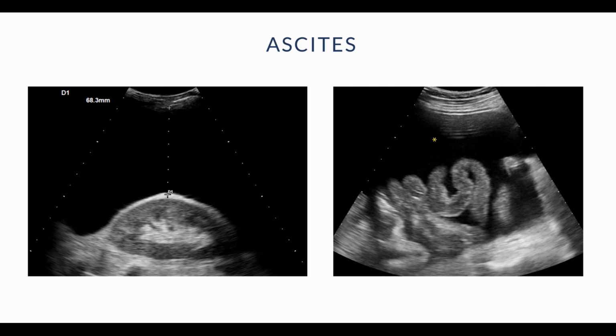Ascites is a common clinical finding and appears as a homogeneous, anechoic collection. Ascitic fluid with a volume as little as 5 to 10 mL may be identified using ultrasound. Measurement of the depth of ascites may reassure the clinician prior to performing any intervention.